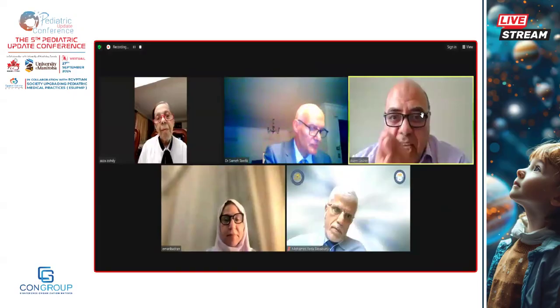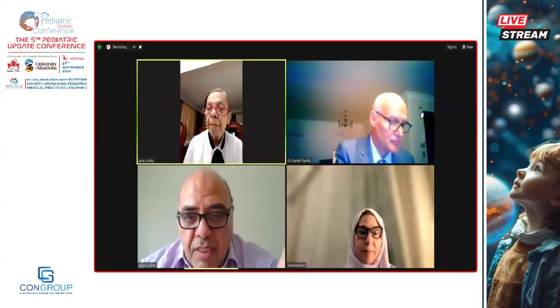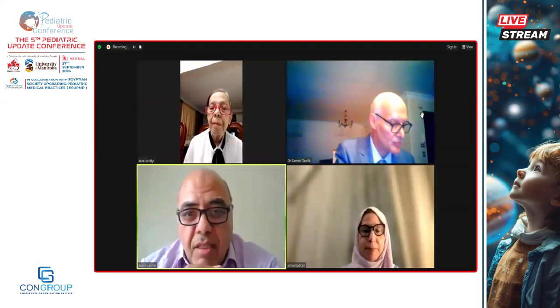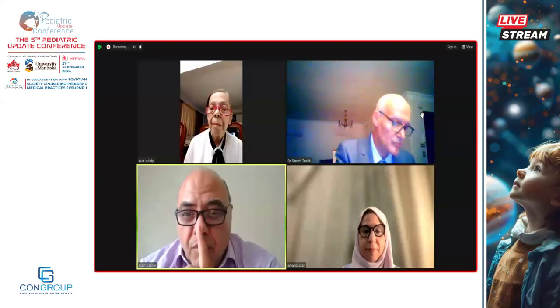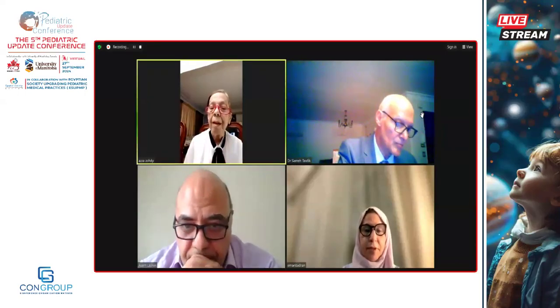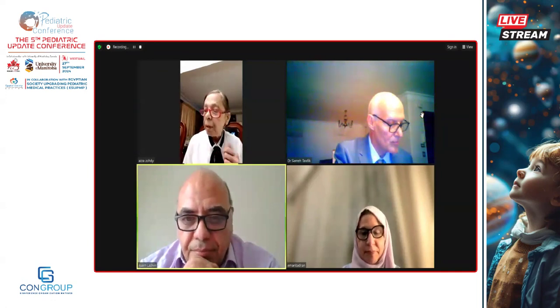But in case of emergency, like our situation with the crashed infant, I think, and Dr. Yasser can correct me if I'm wrong in this, we can use one probe only. One probe, because probably it will be the curved one. Yeah, because in 10 minutes you have to do a lot of things, so you have to focus on this. Yeah, okay. Exactly.